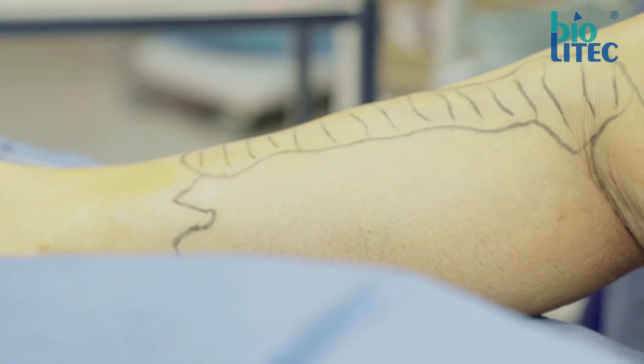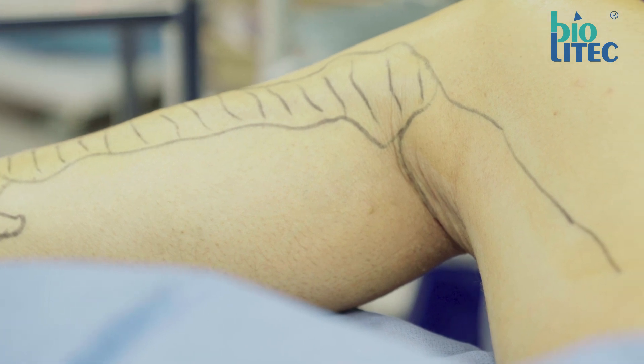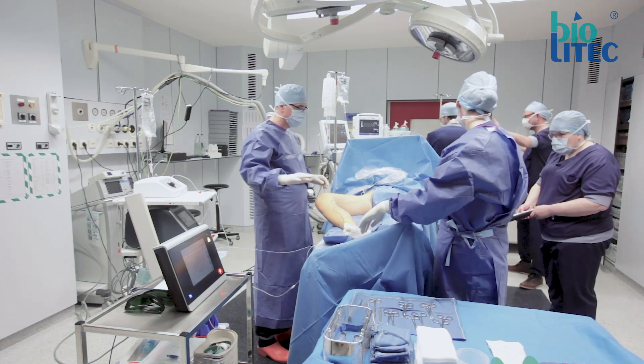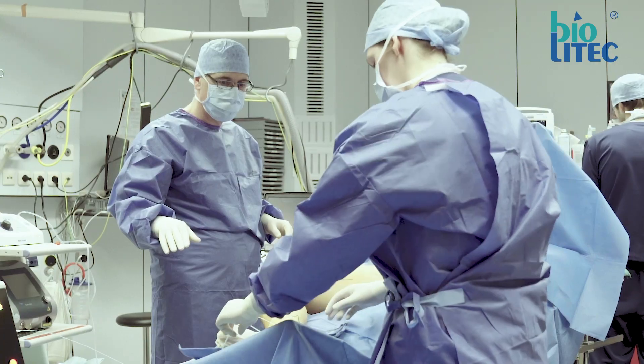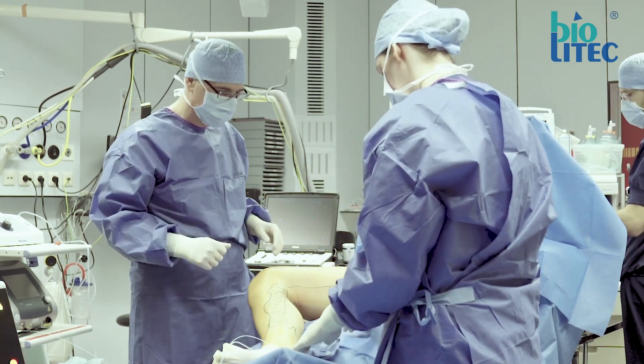First, I would like to show you how we treat an insufficient greater saphenous vein. To get started, we put the patient in anti-Trendelenburg position to improve visualization of the veins. This way there is no need to use a tourniquet.